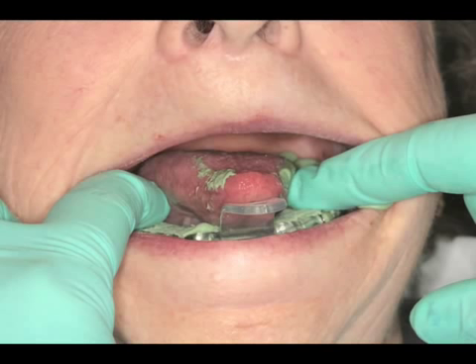We want the patient to place their tongue out, left, right. They can lick their upper lip. We're trying to capture not just the mylohyoid space, but also the retromylohyoid space. We then will hold the tray in position.